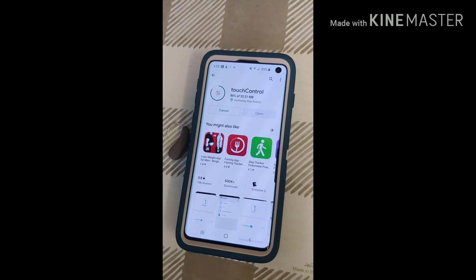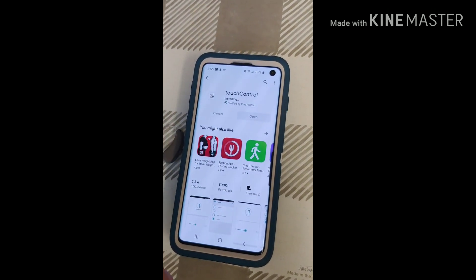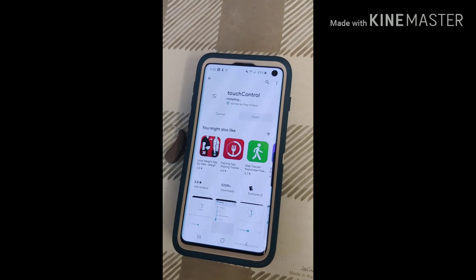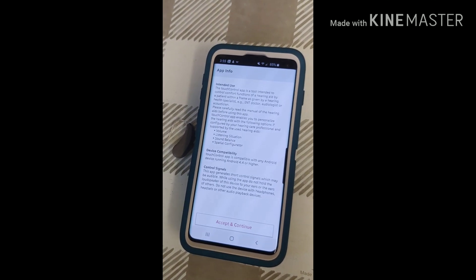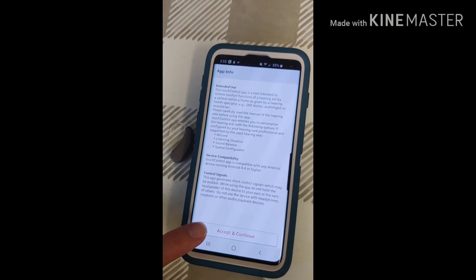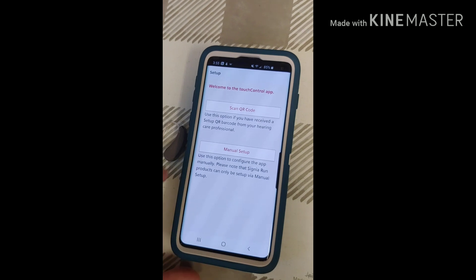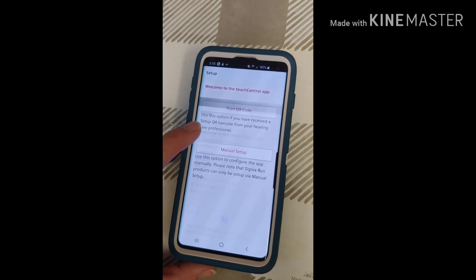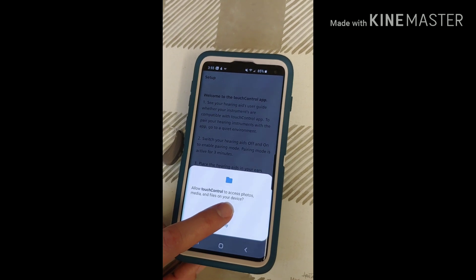Once it's installed, you can open it from here or you can find it on your home screen and open it from there. We're going to open it from here. It's going to walk you through the steps. You're going to hit Accept and Continue. We're going to do a manual setup. You want to allow access for right now.